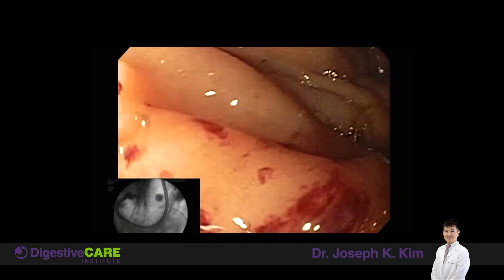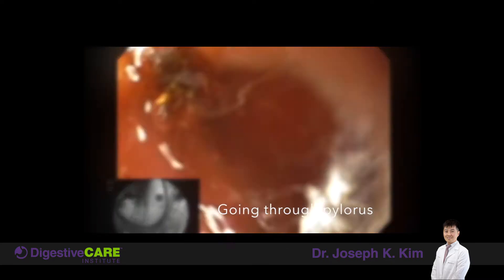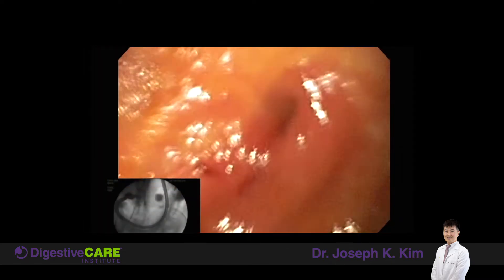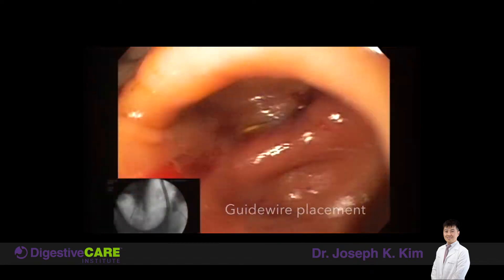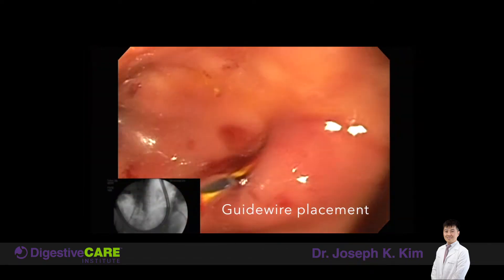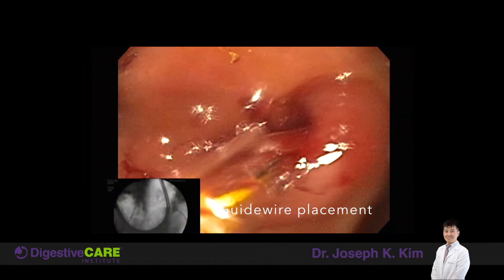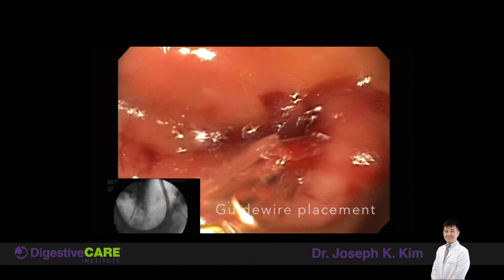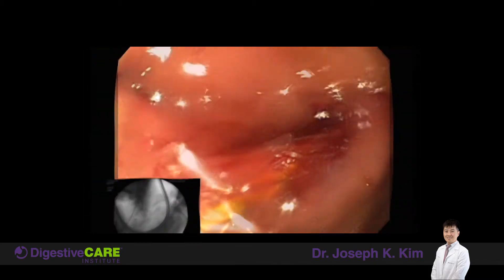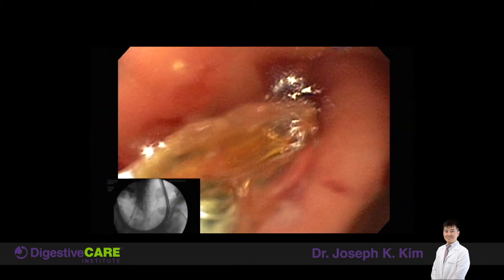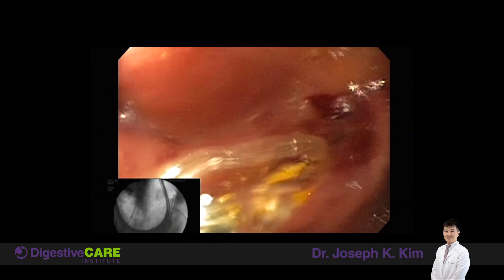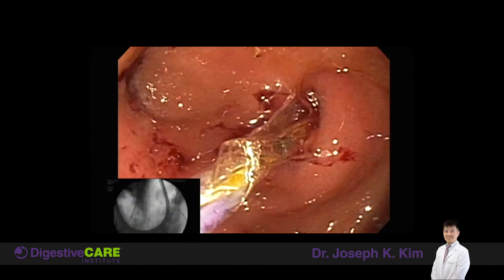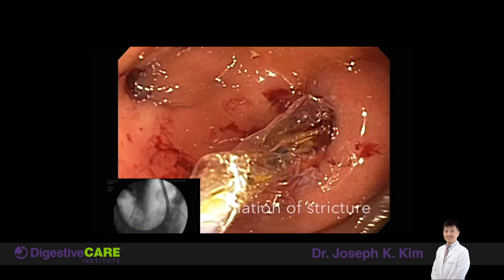This is endoscopic. We're inside the stomach now, and now we've popped into the duodenum, which is the small intestine. You can see that small little opening there that can only be traversed with a wire — the endoscope cannot even go through. I'm using a balloon catheter with a wire, and also using x-ray to confirm that I'm in the duodenum.